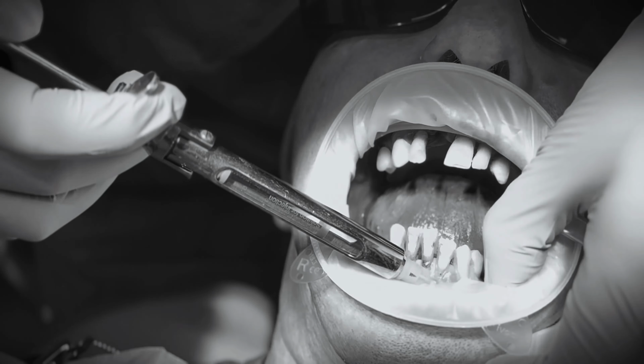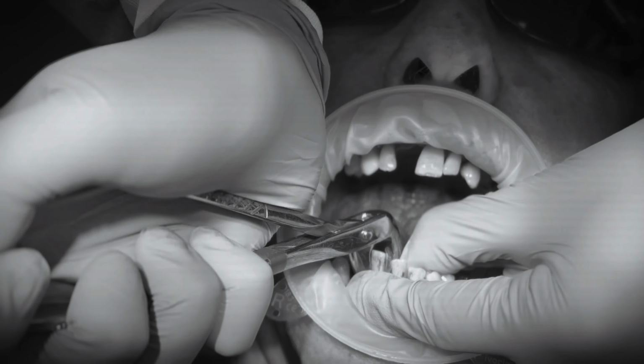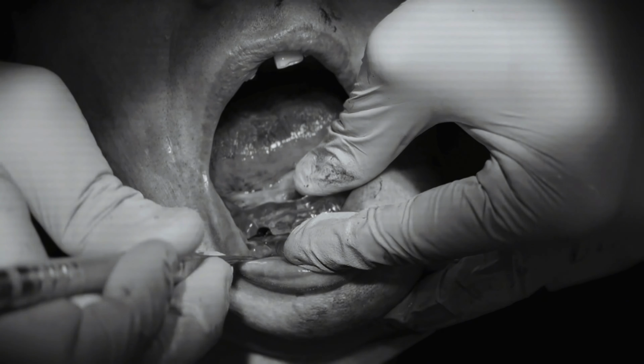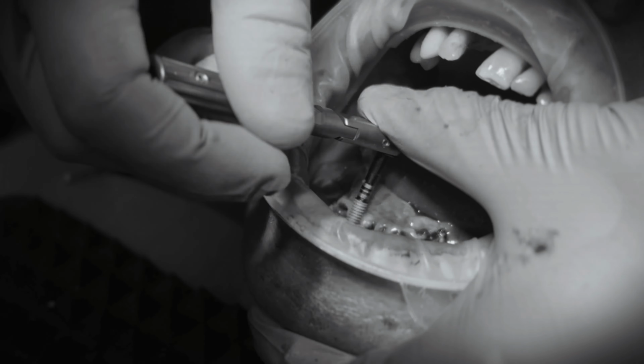After that, on the day of the surgery, we numbed him up, made sure he was super comfortable. We proceeded to remove the teeth. We placed our guides and we were able to drill the positions of the implants into the correct position.